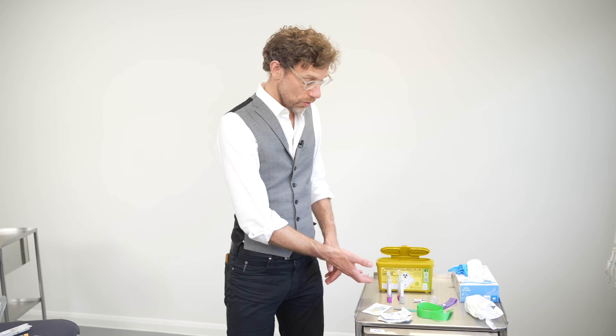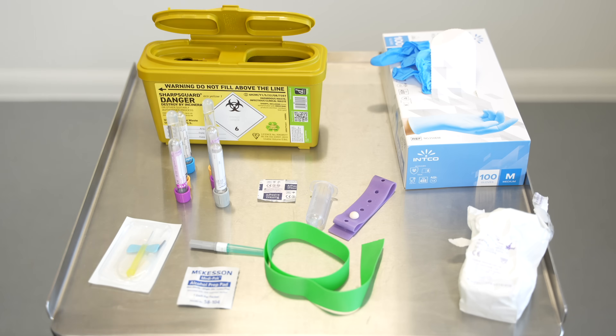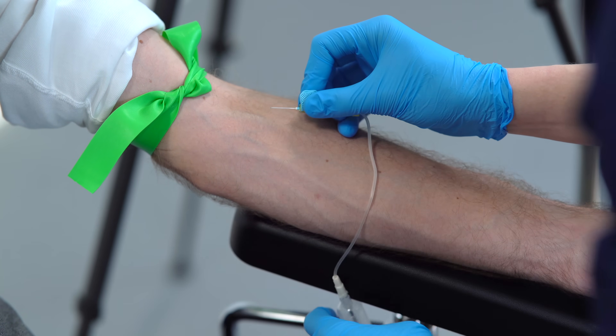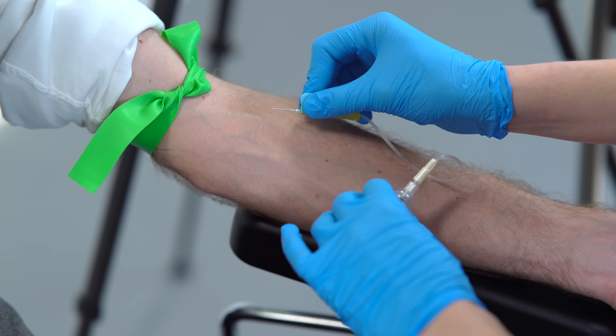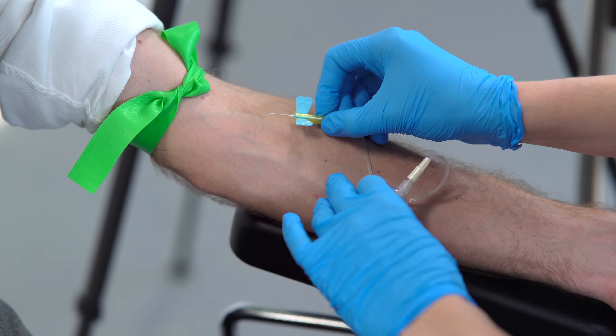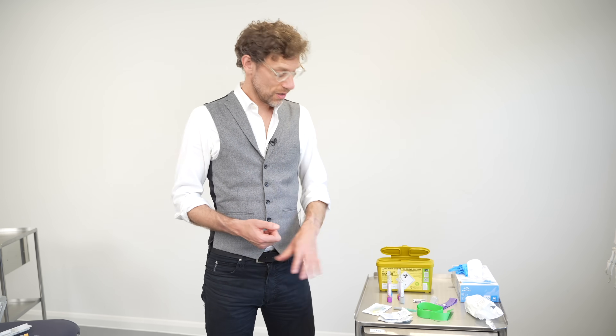With regard to that, I always make sure I have an excess of vacutainers, because there is nothing worse than fighting to get a patient's blood vessel, finally getting there, and then realising that one of the blood tubes has depressurised. If you don't have a spare, you can't carry on using that vein. So make sure you've always got spares with you.